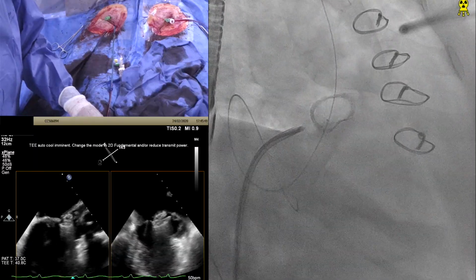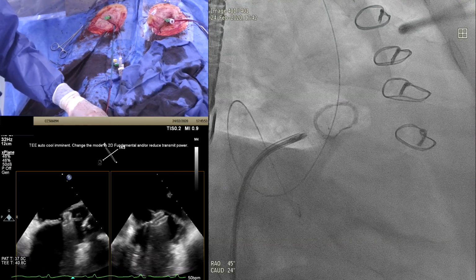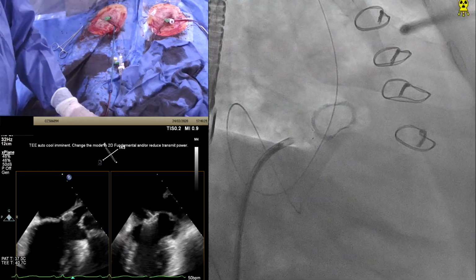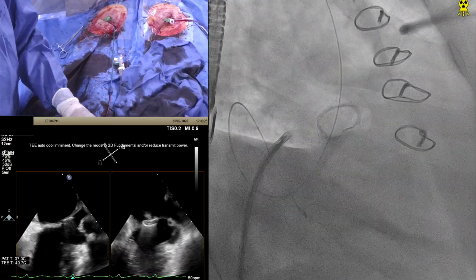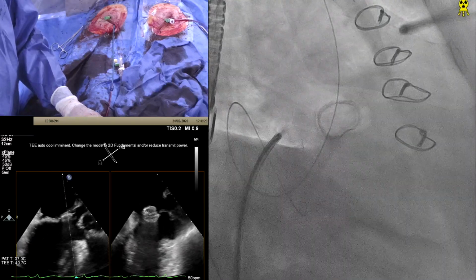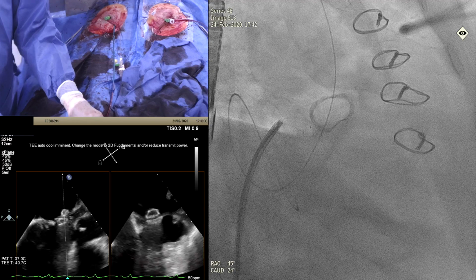You're not quite through to the left atrium side yet. Oh yeah, okay, fine, I got it. Okay, so it was almost there, but not quite. Okay, so we'll try it again. Keep the tension on. Oh, it's a lot of tension on it. Oh yeah. Okay. That's caught it. Oh, that looks good. That's caught it. Yep. Save it.